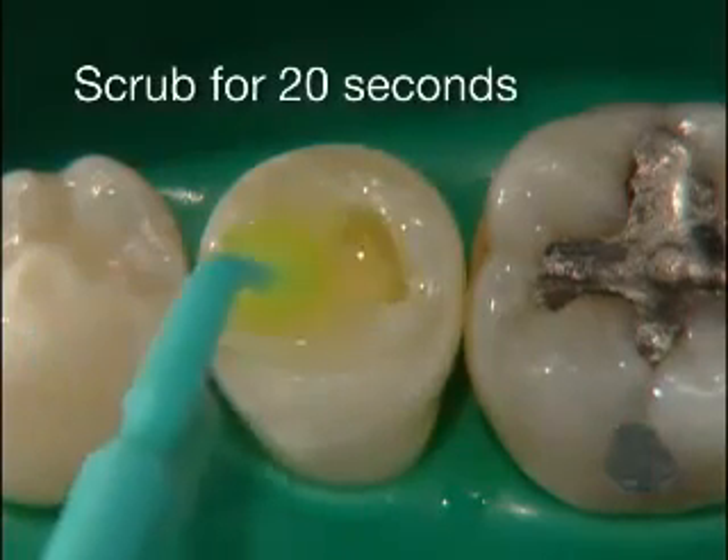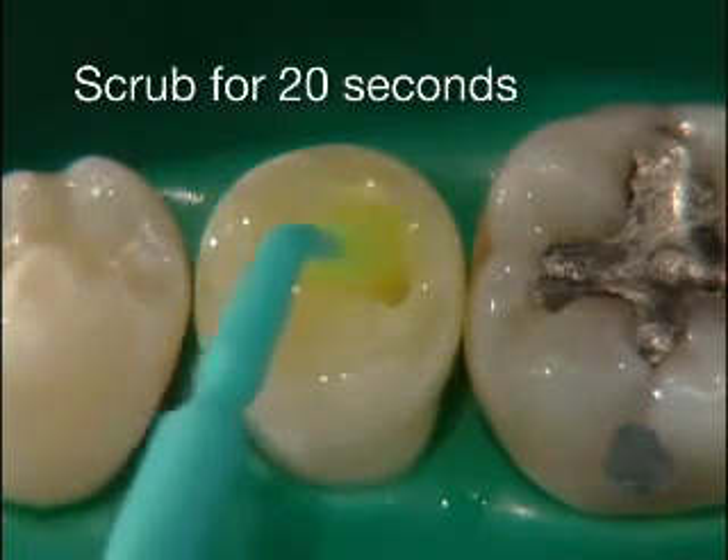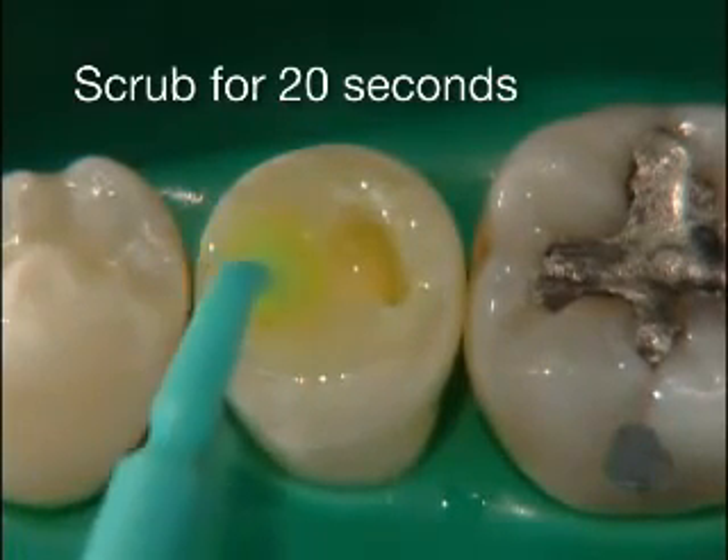Apply the brush to the prepared cavity surface and scrub in the adhesive for a total of 20 seconds using mild finger pressure.